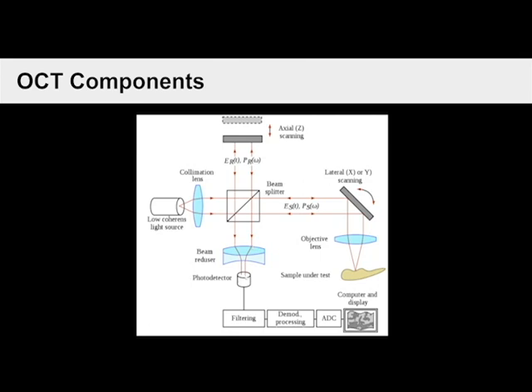The photodetector and the interferometer calculate something called the echo time delay. There's always a time delay between when the reference beam reaches the photodetector and the probe beam reaches the photodetector. And this value is calculated to produce a range of time delays. If both the beams reach at the exact same time, it causes positive interference. And therefore, an interferometer is able to integrate several data points over a 2 millimeter depth to construct the final tomogram. And OCT is a very shallow imaging modality because of this.